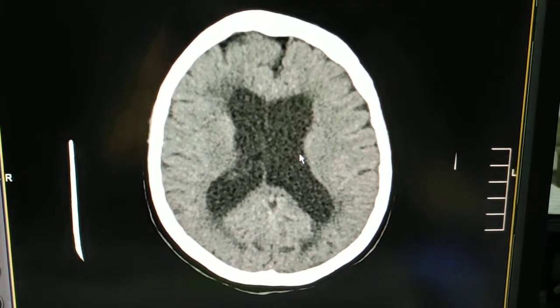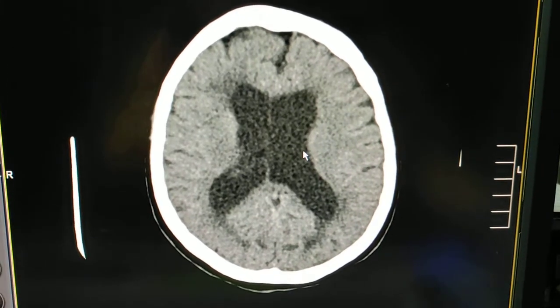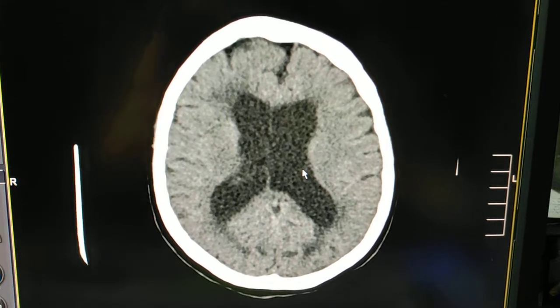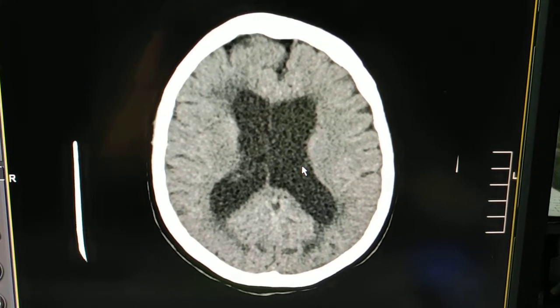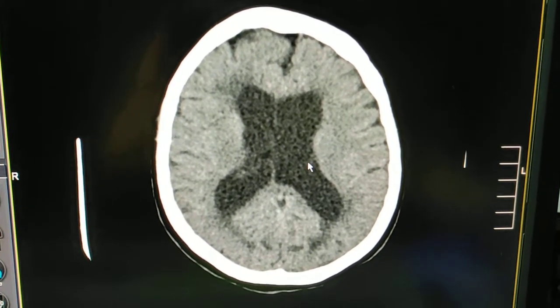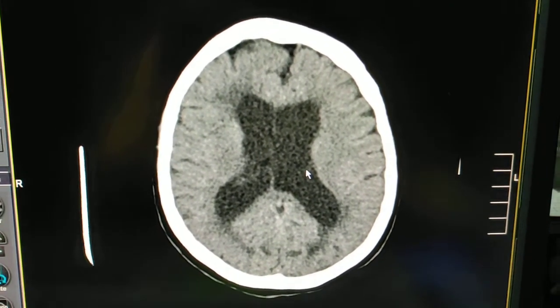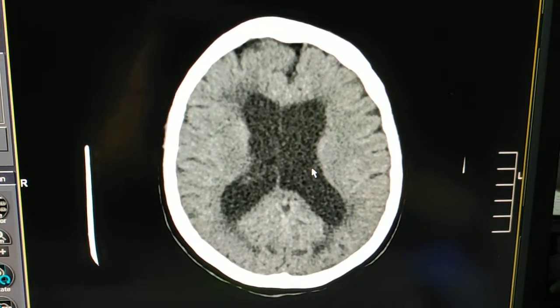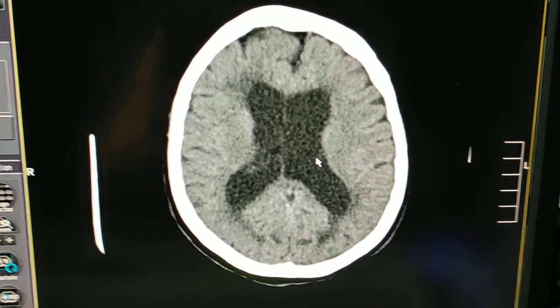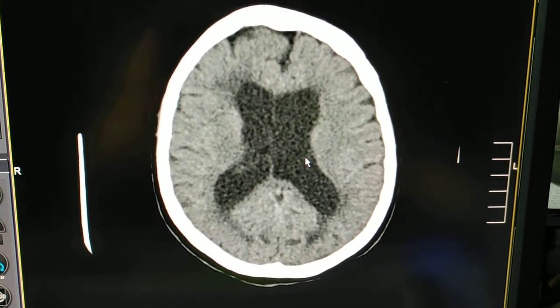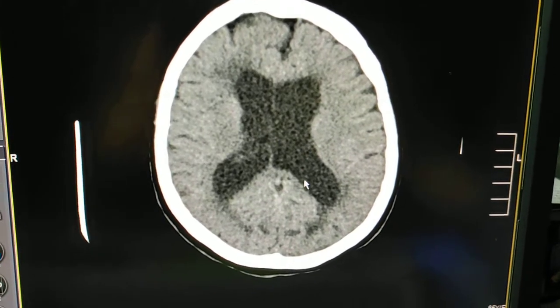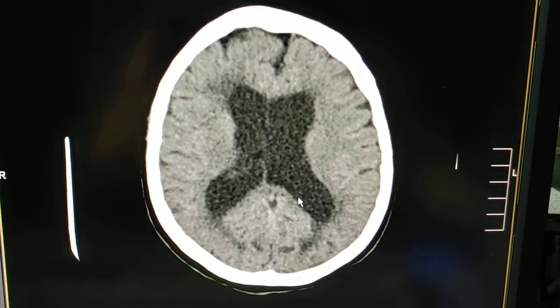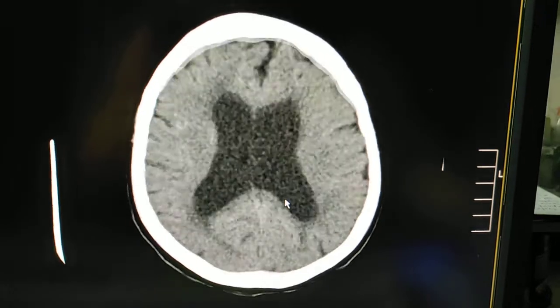Generally in these cases, the patient might present with walking imbalance, gait disturbance, dementia, or urinary incontinence. These are mostly the classic histories for a normal pressure hydrocephalus patient.